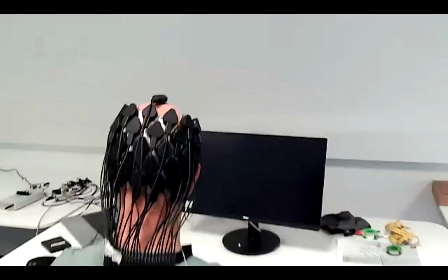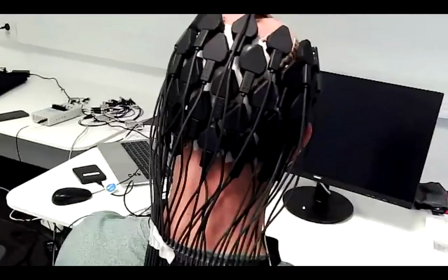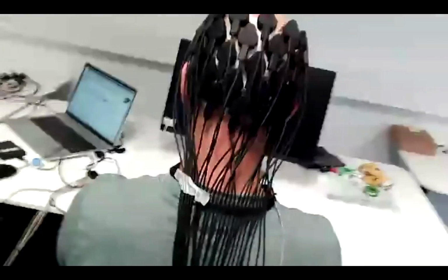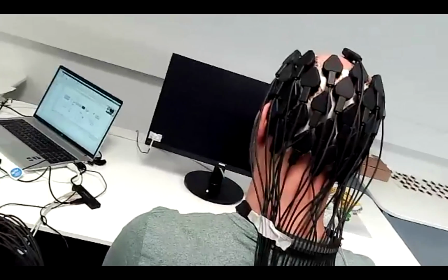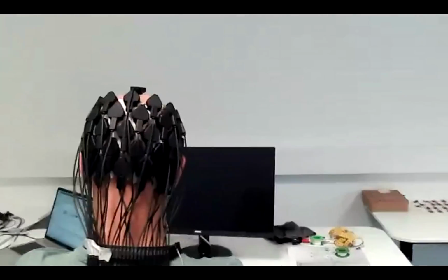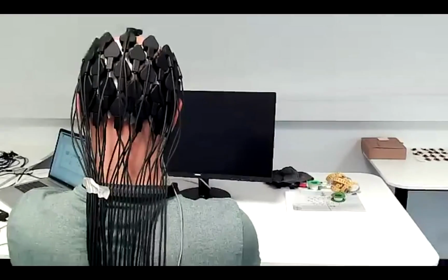So I will just go here with the camera to show you the setup that we do for 512 channel visual experiments. So this is here covering the whole occipital region.